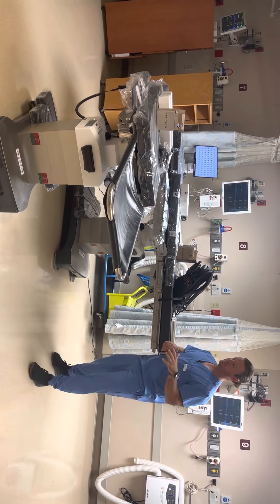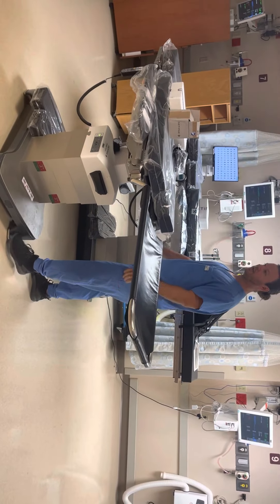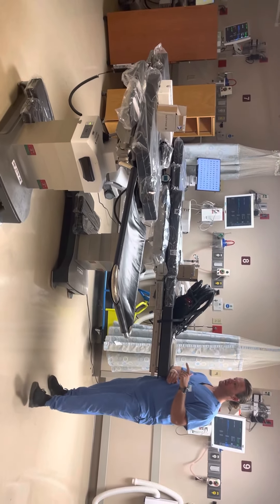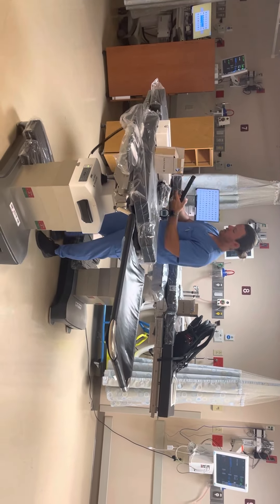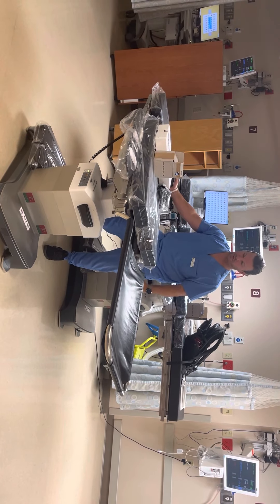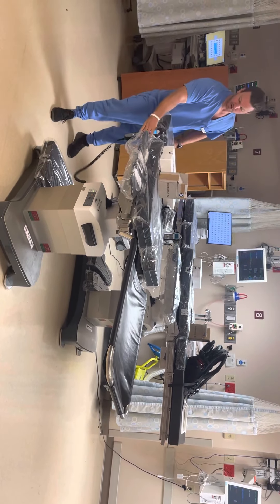First and foremost, just as far as general orientation to keep in mind: this is the head of the table, this is the toes — that's how I like to think of it. This is always your foot end. You can always reverse the orientation of the table on the remote or on the column. This table can go from 23 inches at its lowest position all the way up to 42 inches at its highest, so you'll have more than enough capability to make things as ergonomic as possible.